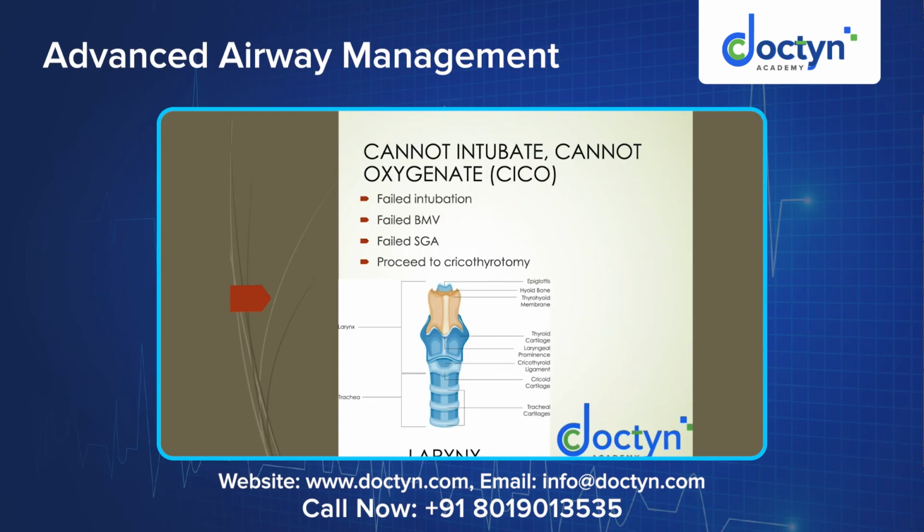Okay, so now you have declared that you are not able to intubate because of trauma which has happened while inserting the endotracheal tube or trying to insert the endotracheal tube. There is a trauma or some laryngeal edema or a laryngospasm which has happened. Once you try to oxygenate, you're not oxygenated well. Now with a supraglottic airway device or mask ventilation, after you tried intubation, are you able to ventilate?